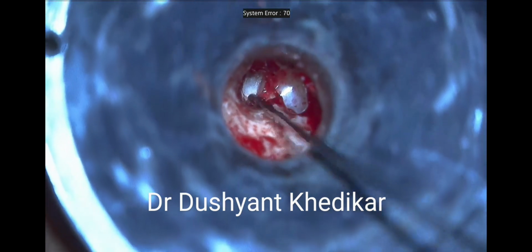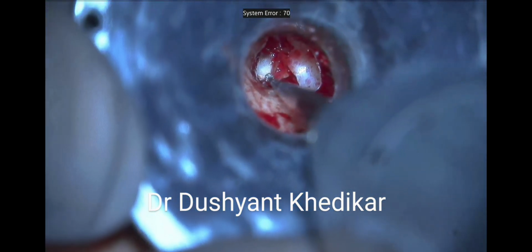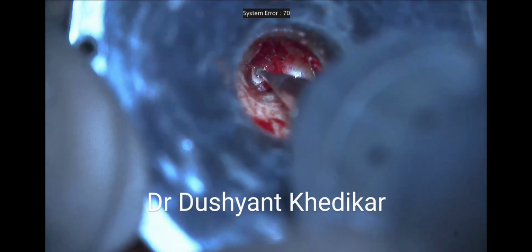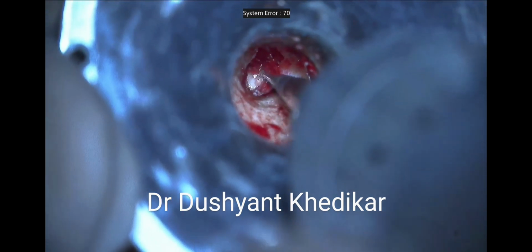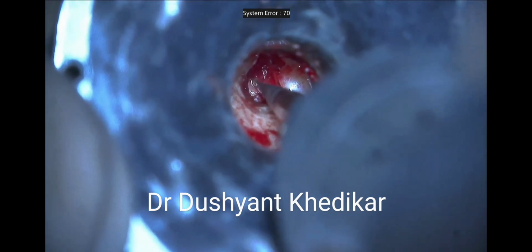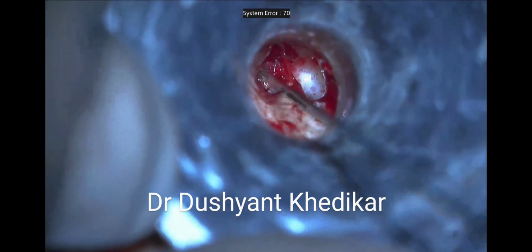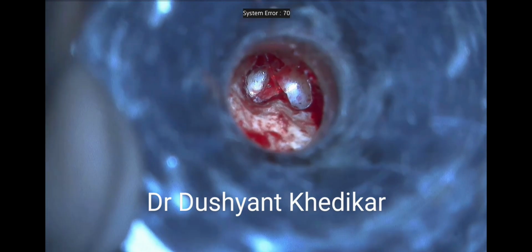While the saucerization is done, care is taken not to apply any force over the drill. In the present circumstances, I am using a 0.6 mm diamond burr at a very low speed. After every drilling attempt, suctioning is done over the footplate area to clear the debris and bone dust accumulated over the surgical field.